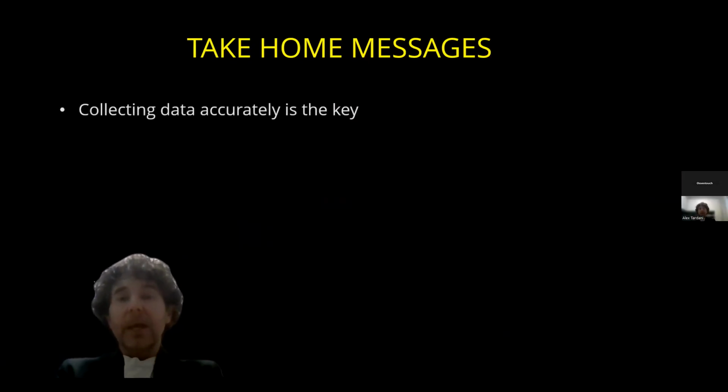So, running a little ahead of schedule, as is my usual way of operating, we get to the key aspects of using the mallet. From the guided surgery perspective, the key for all of us is to acquire data correctly. Because planning is fantastic. It saves us time, makes us more precise. We gain a lot of things. But if it's not done meticulously, it automatically leads to an accumulation of errors that cannot be corrected during the surgery itself.